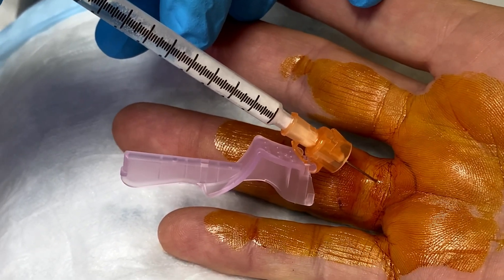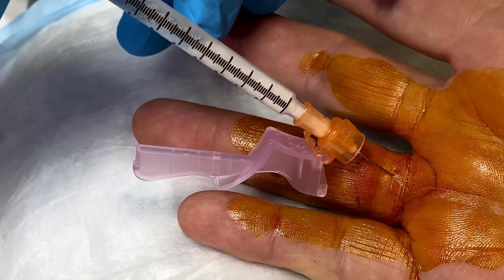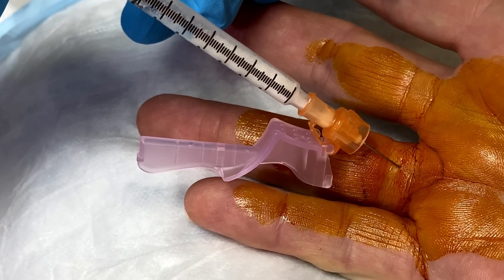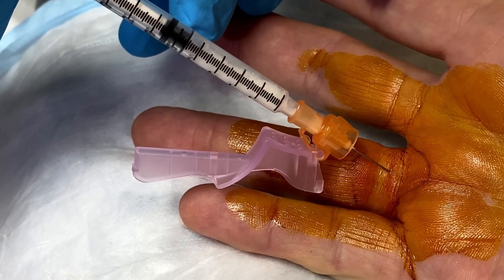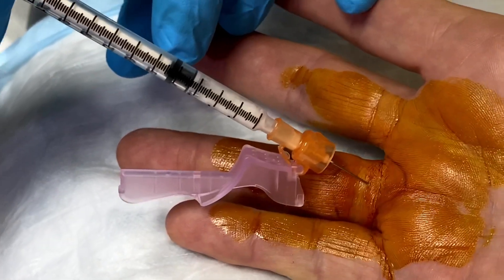Actually, it's not going in, so I'm going to pull back just a little because we're in the tendon. Just a little more — there we go. So we're now in the tendon sheath, and it builds up a little pressure as it fills up. Pull back a little bit more.